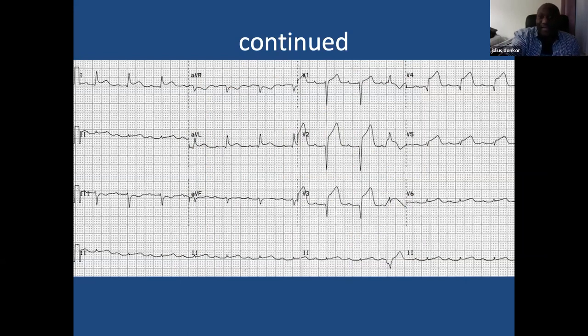And it's got a slight lateral extension, so it's an anterolateral MI actually, and you can clearly see reciprocal changes in your inferior leads there. You can see that in lead 3 and also in lead 2, so much more in lead 3 and aVF actually. The level of ST elevation in anterolateral is not always equaled by the level of reciprocal ST changes.